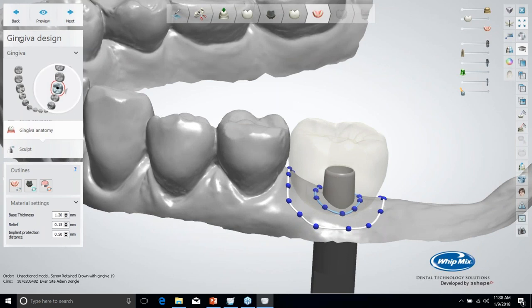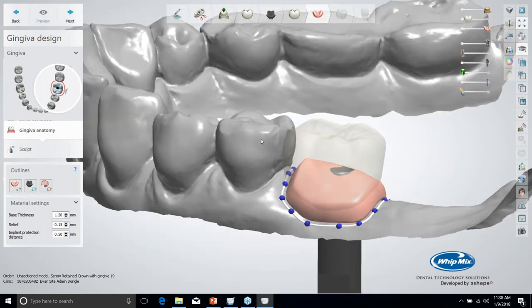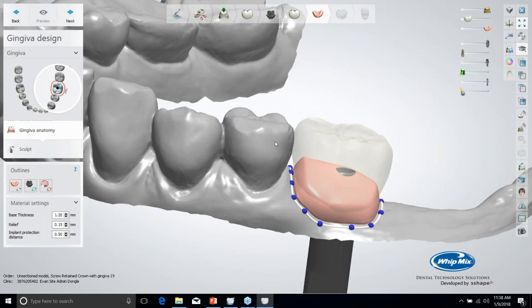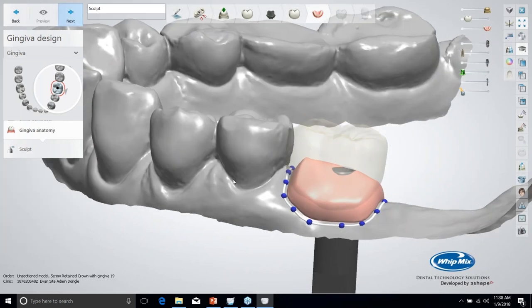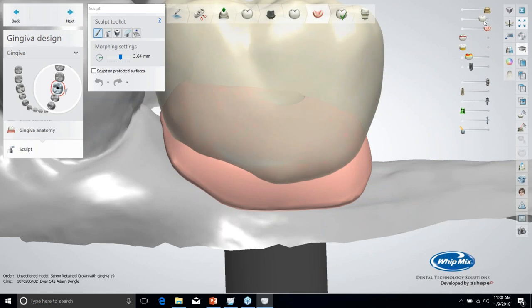So now that I have those two lines, I'm not going to add any relief. I'll just click preview so you can see what it's going to do. So there it's created its 1.2 millimeter thick tissue. So now I can go next and I'll have a sculpt stage. Bring my crown in a little bit where I can start sculpting this tissue.